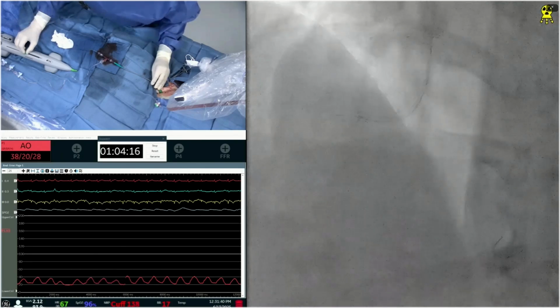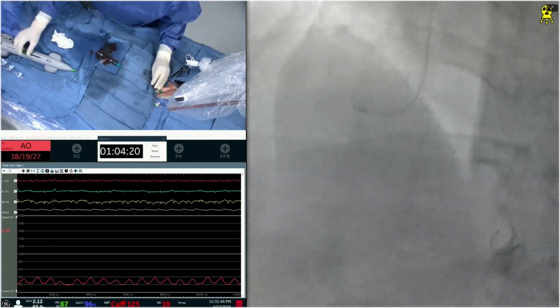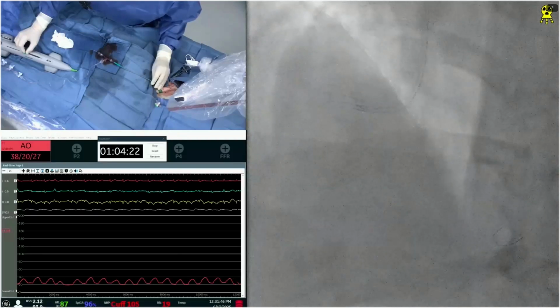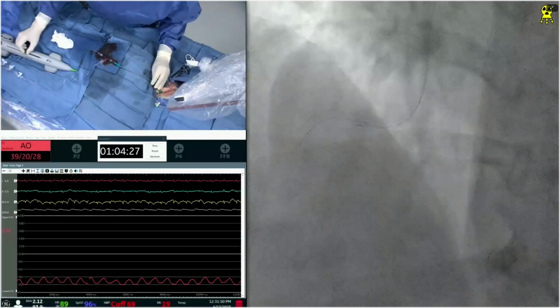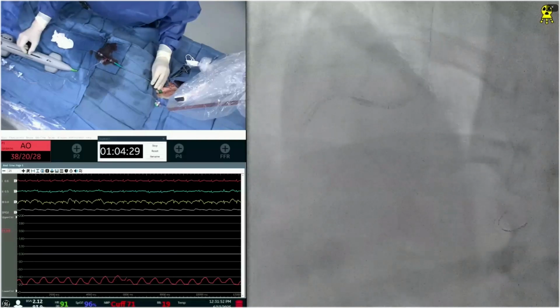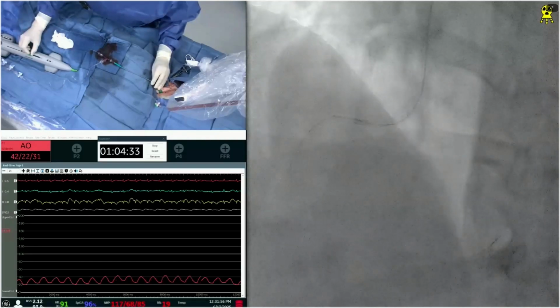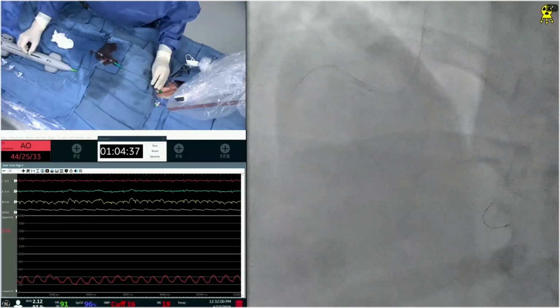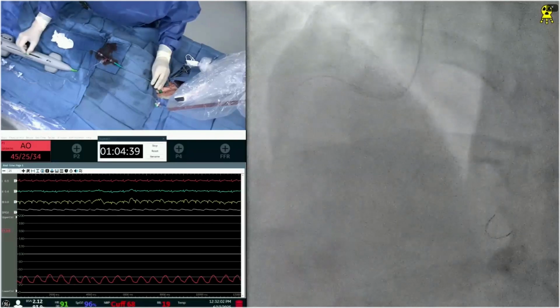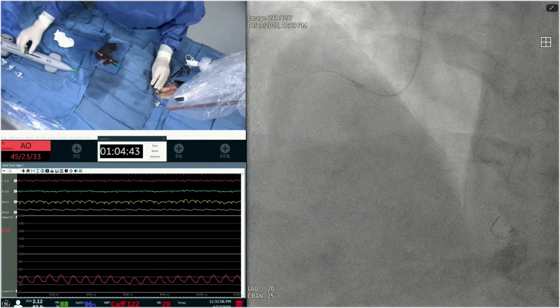And even if you crossed it, compared to Rota, when you are done, you do one polish. You don't need anything more here. Every time you do it, particularly, it will give you a better lumen, and we do 80,000 RPM. In our lab, we used to do probably like 10% of the 65 cases with rotablation, atherectomy in the past. Now actually about 10-15%. Now it's only maybe 1 or 2 cases per month, which I have to do.